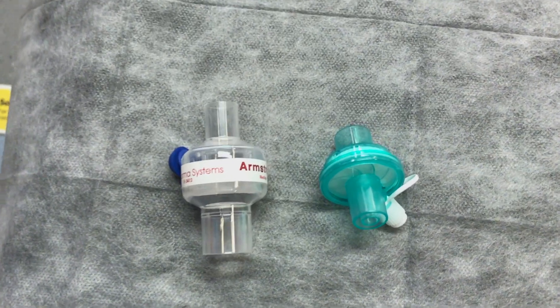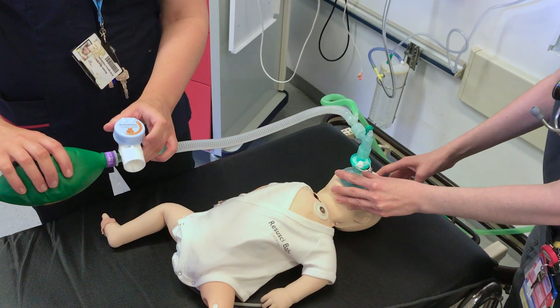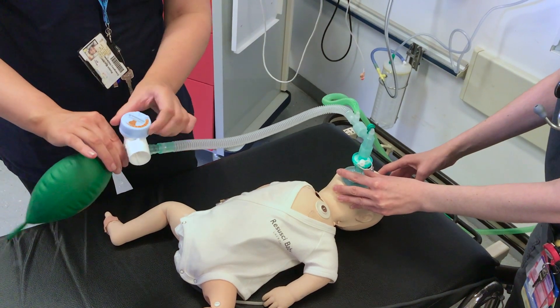Attach your bacterial filter and then attach that to the C-circuit. Turn your wall oxygen to 15 litres per minute and adjust your PEEP — this is via an adjustable pressure limiting valve. If it's partially closed, most of the air goes out to the patient, but if it's squeezed excessively then the excess will go out through the valve, so you can't give too much trauma.